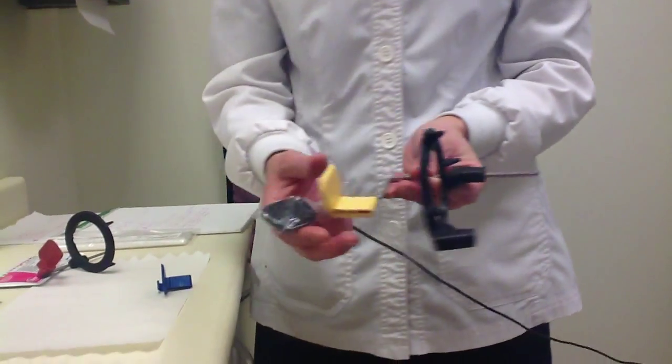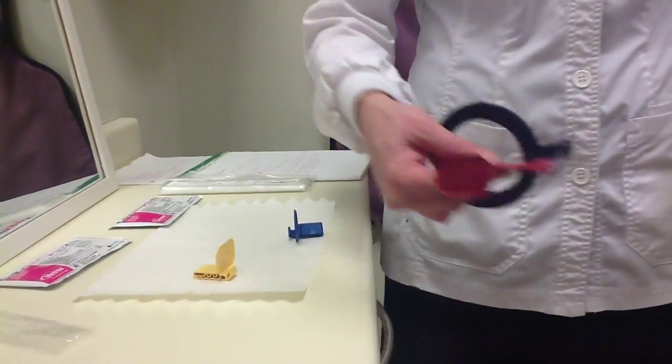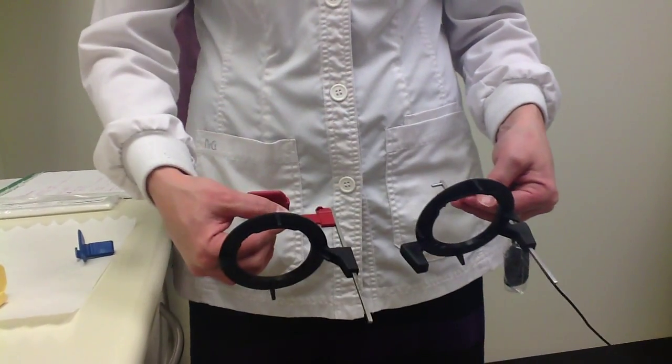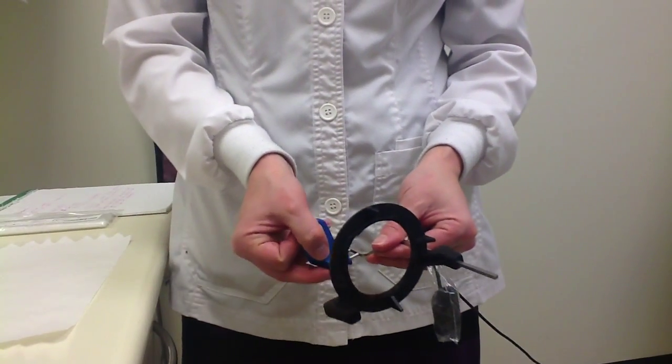When we look at our PA setup, we notice that the rod isn't straight like our bite wing — it has a curve, like an L shape. This will be for our posterior or anterior PAs.